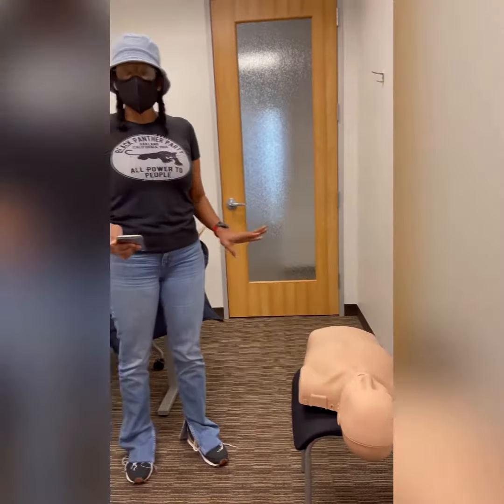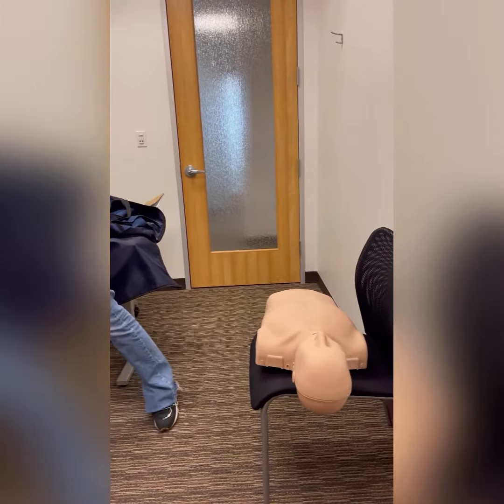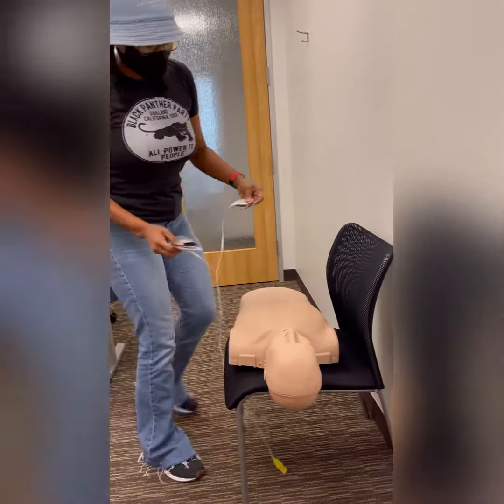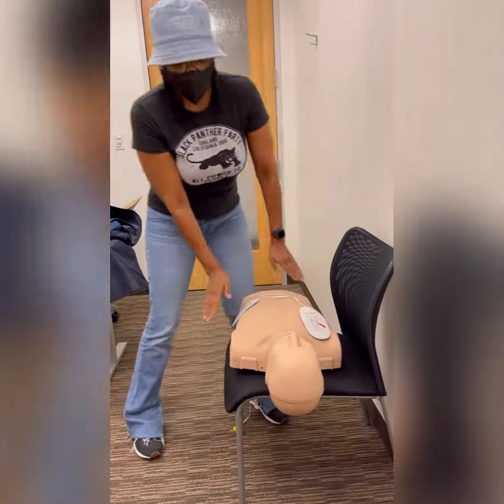Okay, so at that point, we're going to shock them. We're going to put on the defibrillator pads and we're going to shock the patient. We're going to put the pads here and here. Tell everybody to stand clear while we shock.